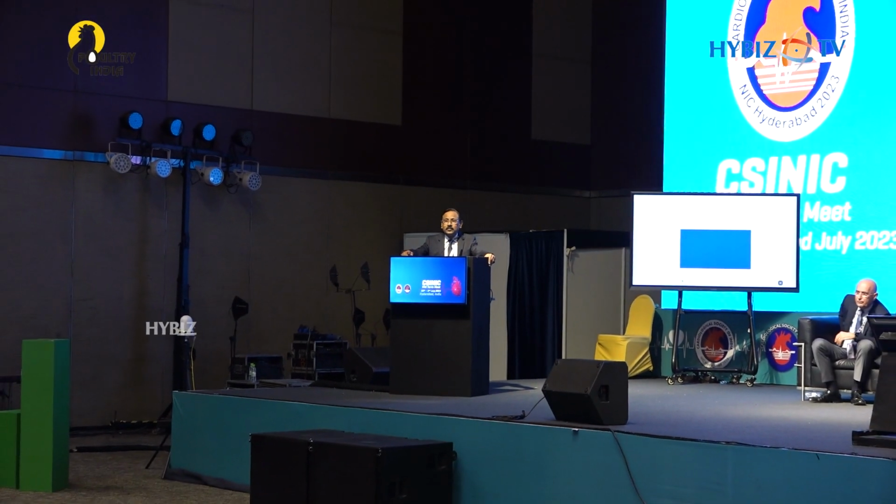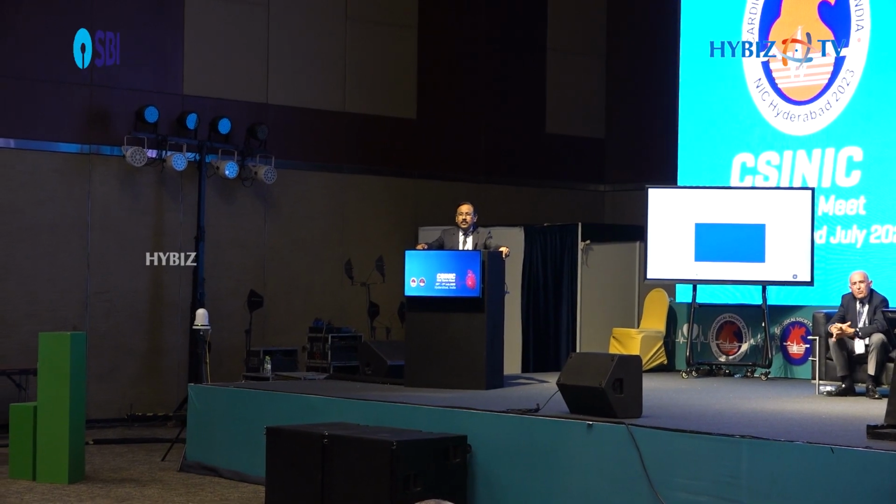One short final question by Dr. Anil. We should not forget that FFR is a continuous variable, and we should not run away from the fact that we recognize this. When the DEFINE PCI results came, we were all alarmed that 25% of what we have done is inadequate. But truly, we can define it better. And if you have a DEFINE PCI-like result, then you probably do imaging and decide what you can do. If it is focal, you can relieve it. If it is diffuse, you have to leave it and rely on medical management. I think Alan Jeremias is more forceful, and he is pursuing to get 0.95 in each and every case so that the residual rate will be practically nil. We'll get the results soon.